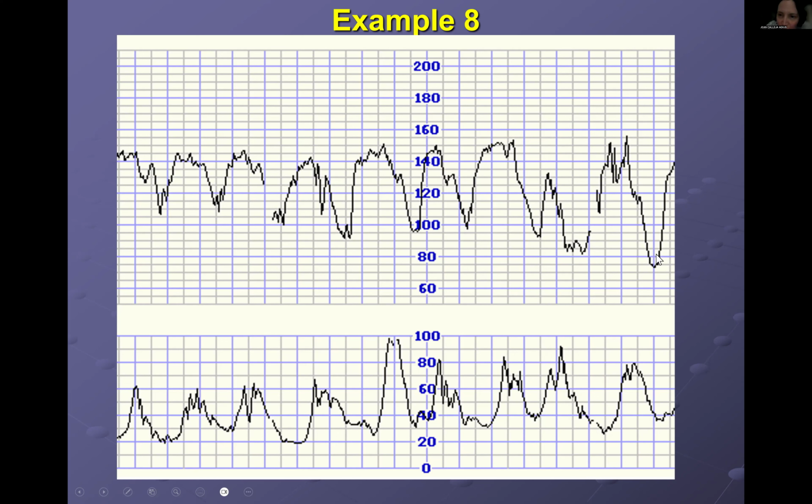And they are getting worse. You're right, okay. They're getting deeper and wider. So late decelerations. So what is your overall assessment? Is it reassuring or not reassuring? Prof, this is a non-reassuring CTG, definitely not reassuring, coupled with the fact that baby is also in a malposition.